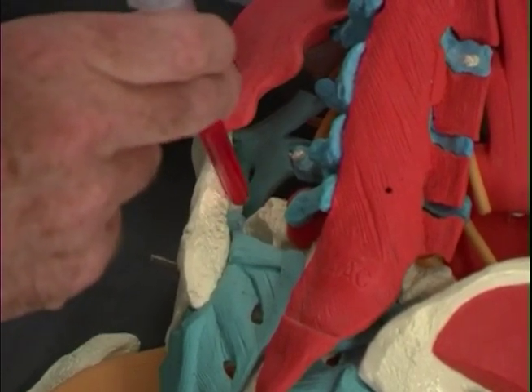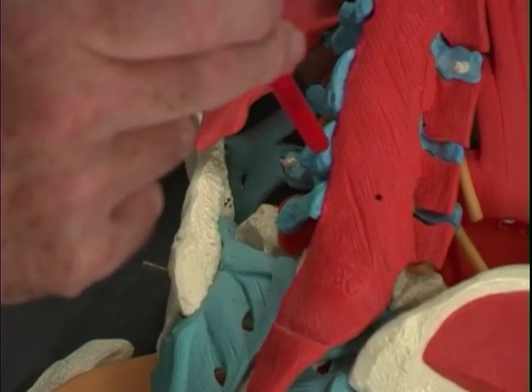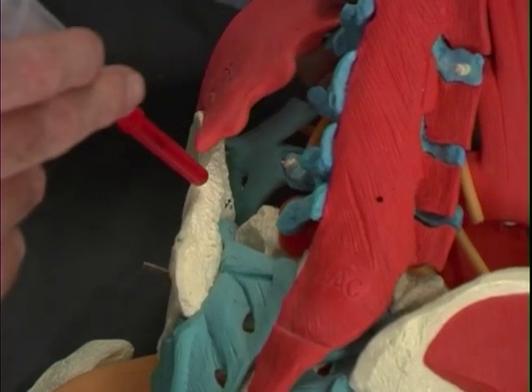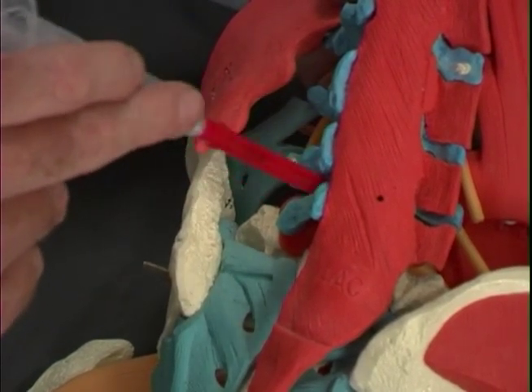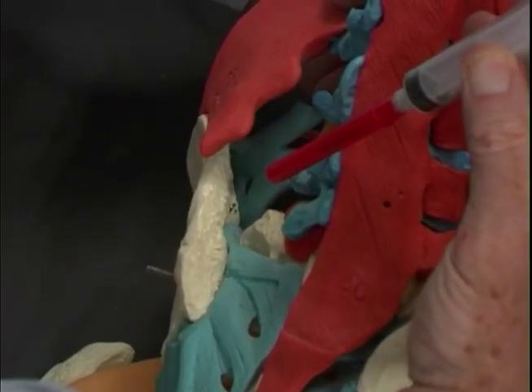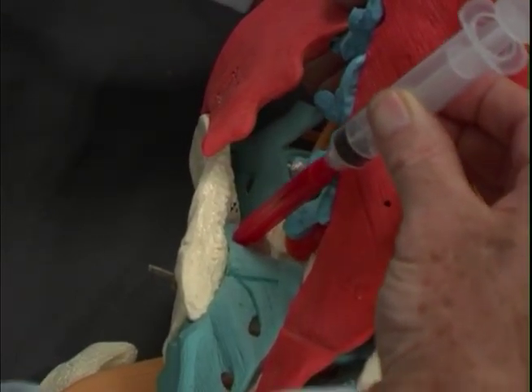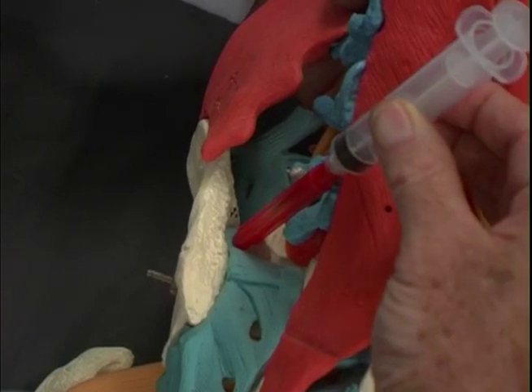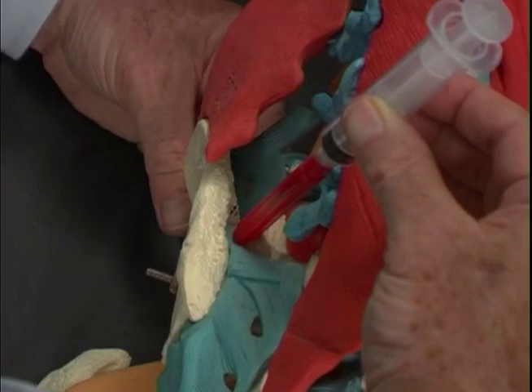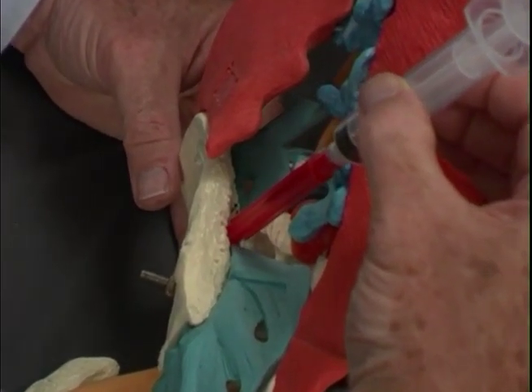We can also reach that point and that area of the deep interosseous ligament by going approximately halfway between the spine and the ilium at the L4-5 level, and with our needle directed in a caudal and lateral direction, sliding into that cleft, getting deep in and again hitting bone. Injections in this area will often cause a warm feeling down the leg or a sensation down the leg. But this is an important area to hit that deep interosseous ligament.